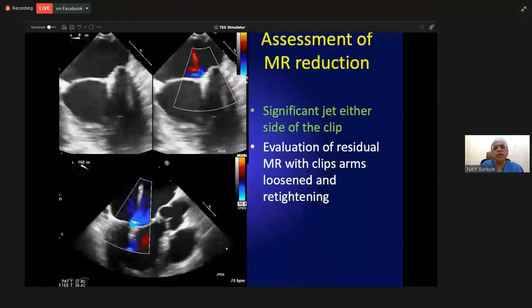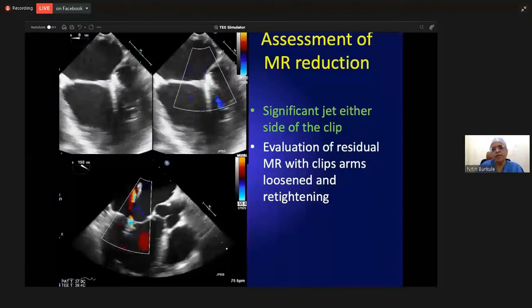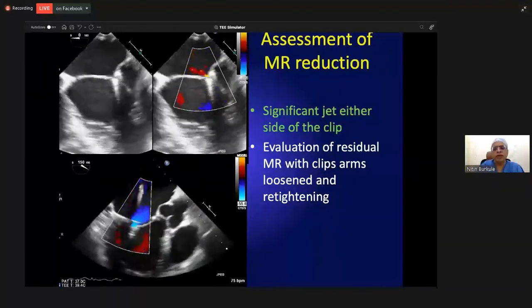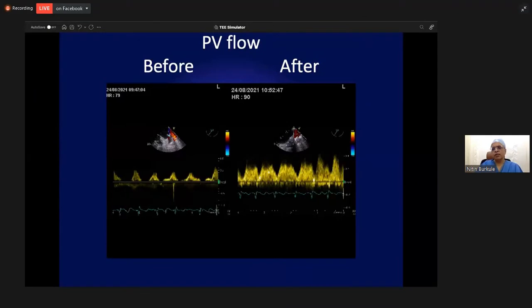Both the 3D TEE and the 2D TEE have become indispensable for most of the mitral valve procedures, especially the mitral clip or the transcatheter mitral valve replacement. And immediately on the table, you can look whether the MR has reduced by looking at the behavior of the pulmonary vein flow. Before the clip, you can see there is hardly any systolic forward flow. The moment you have closed the clip, there is a good amount of forward flow in systole, telling you that the LA pressure has dramatically fallen.